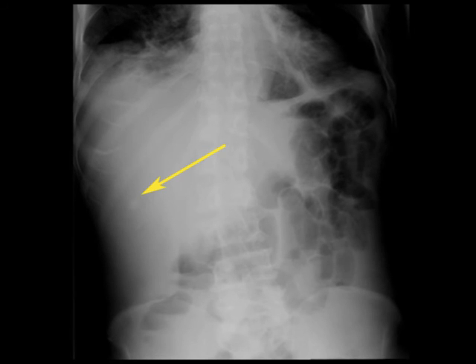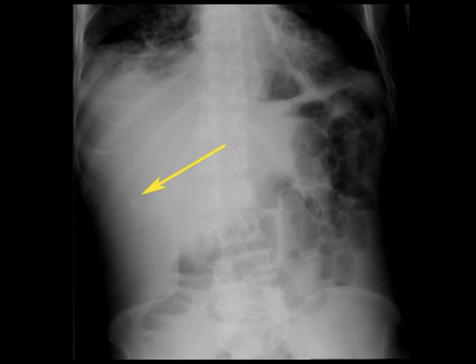But this is an example of an accessory nipple, and one of the clues to that is it is very, very well defined. The edges are well defined, and anything on the skin can look like that and will show up very well on an abdominal x-ray.